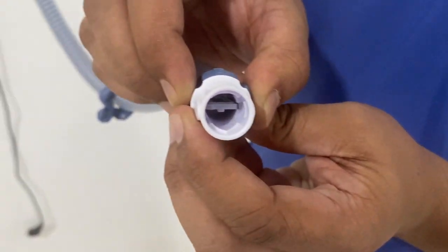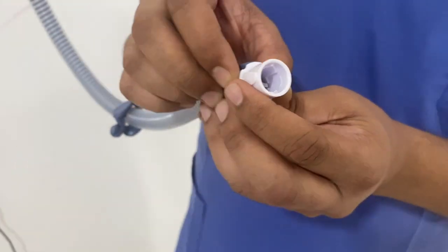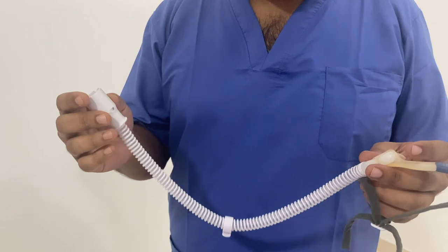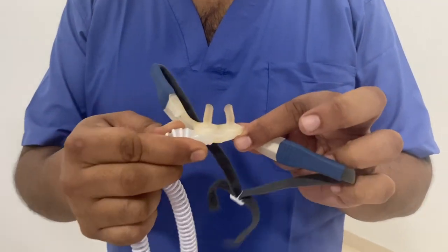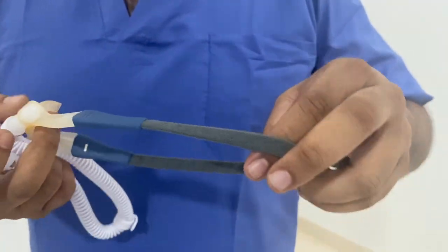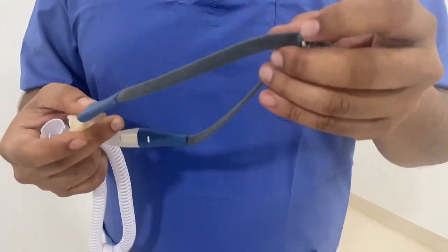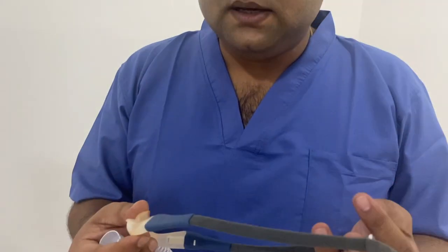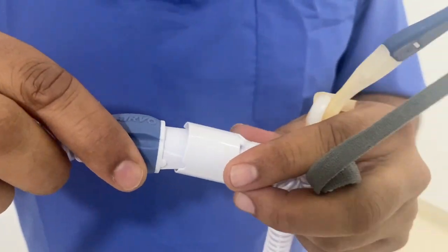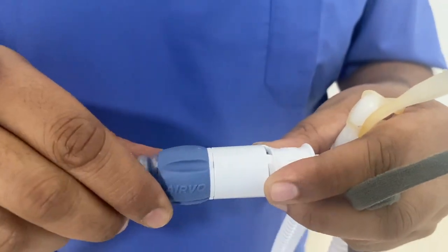There is a sensor at the patient end that again ensures that the humidity and temperature of the air flow is maintained. This is the patient interface — an adult nasal cannula. This is the nasal port that goes into the nostrils. This is an adjustable strap that has to be tied around the head. The strap should not touch the ears. This has to be connected here — again, a clicking sound confirms proper fitting.